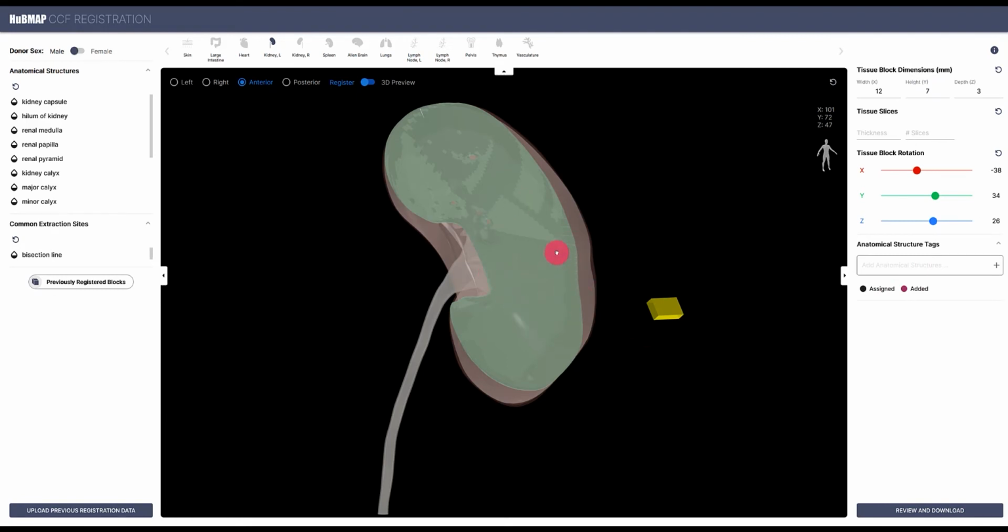So we used collision detection, which is a feature in many 3D engines, which allows you as a user to detect collisions between two 3D objects. We see that all the time in Hollywood movies or in video games. Typically, after two objects collide in a video game or in a movie, you have an animation or an explosion. Here we have something very innocent happening. We just get an anatomical structure tag.